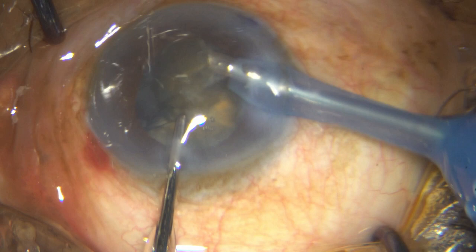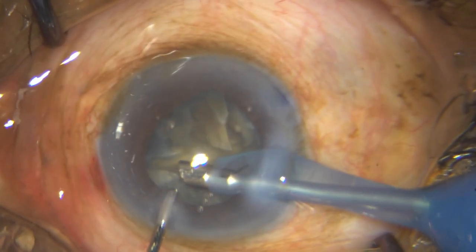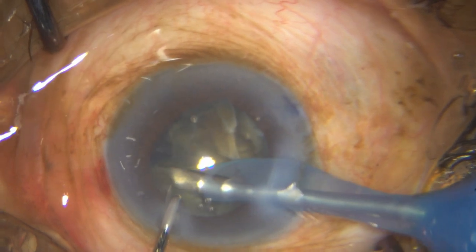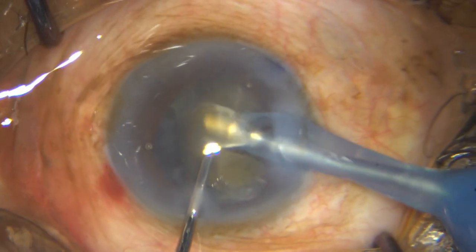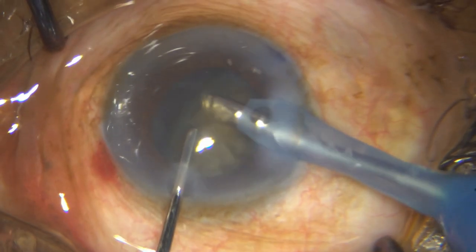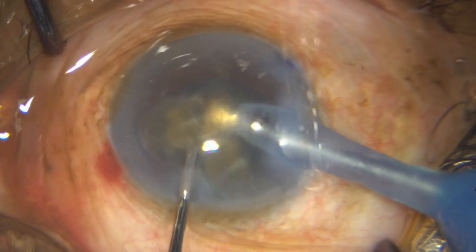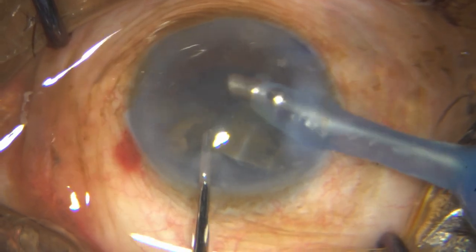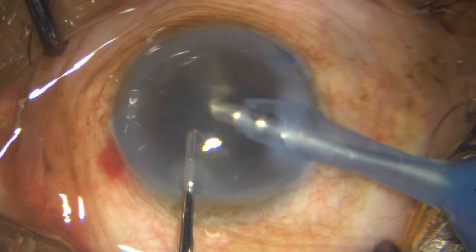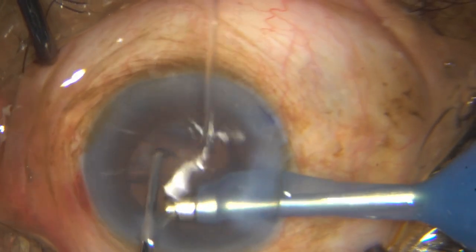Watch how my phaco tip is being placed — I bring it out, bring it to the center, and I am essentially turning my phaco tip posteriorly. There was a little bit of turbulence and pieces going around; can't help it, but by and large try to avoid that.